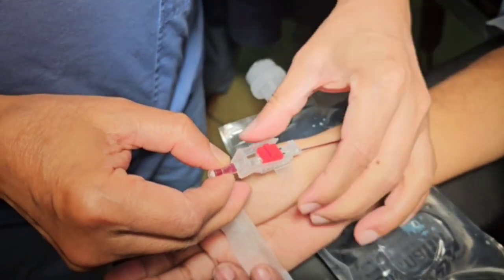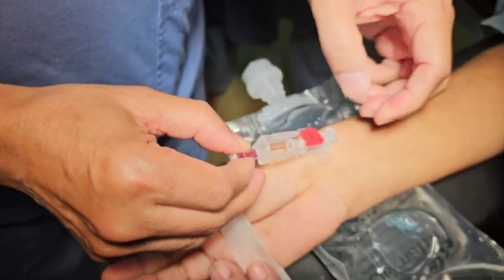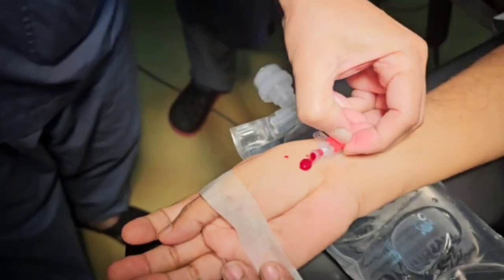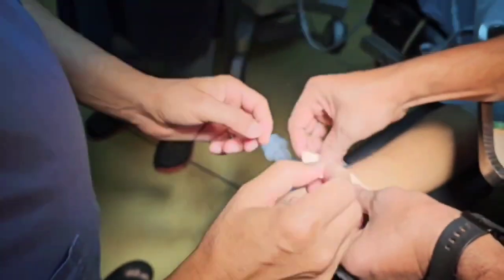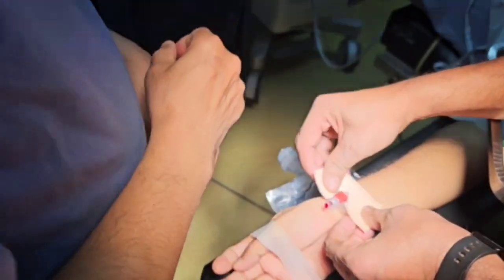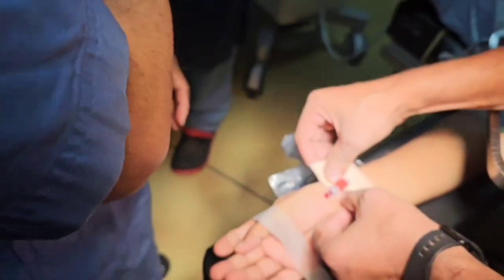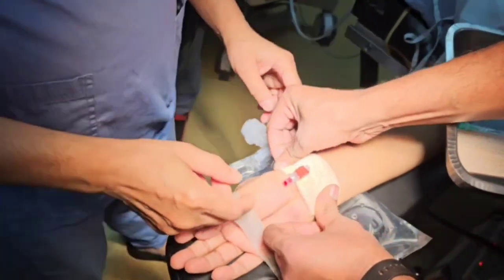When pulsatile blood is seen, the needle is slightly advanced inside the catheter with reduction of needle angle to 10 to 15 degrees, and we advance the catheter over the needle. After that we fix the catheter with leucoplast dressing and flush the catheter with heparin solution.